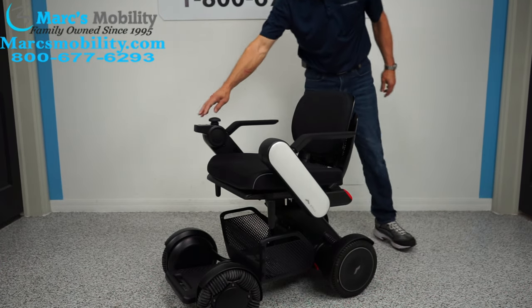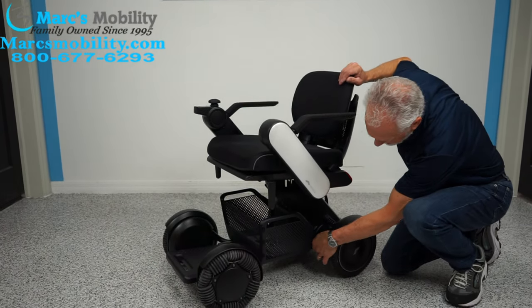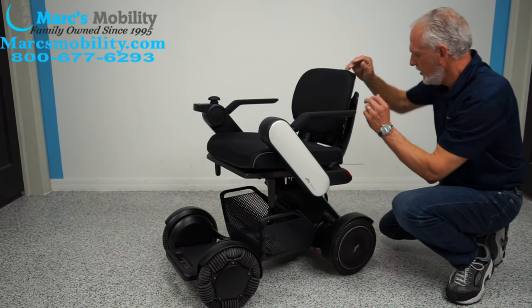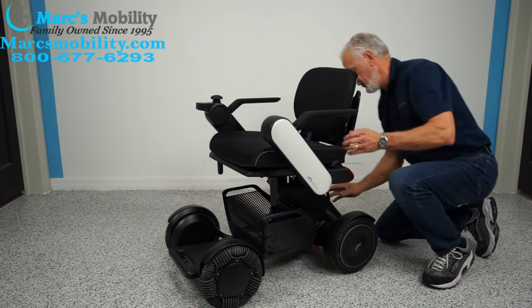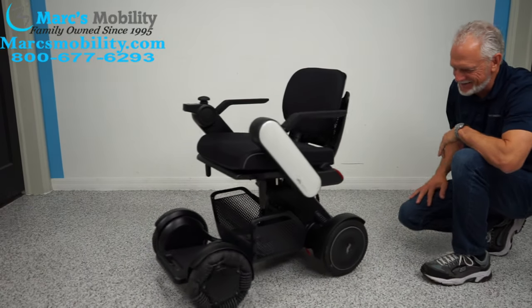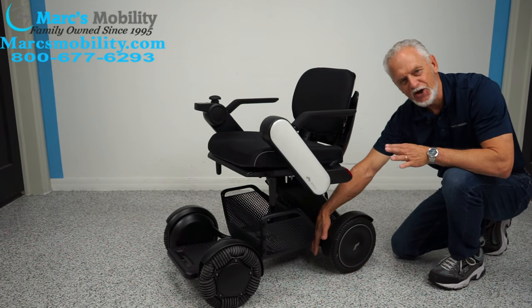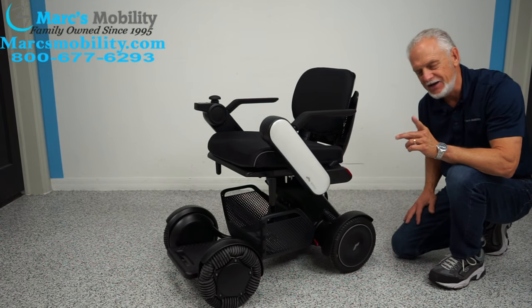This is how you put your chair in freewheel. Turn the power off — you see the little red lever here? Push it down on both motors, and you can see how easy it rolls. Your lever's right here — but don't forget, when you're done, put your chair back in gear.